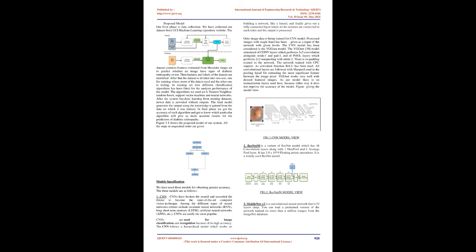Gardner et al. worked on determining whether neural networks are able to detect the diabetic features prevailing in fundus images, along with comparing the network against an ophthalmologists' screening set of the fundus images. The work showed the detection of hemorrhages, exudates and vessels. Further, comparing with ophthalmologists, their network attained better accuracy for detection of diabetic retinopathy.